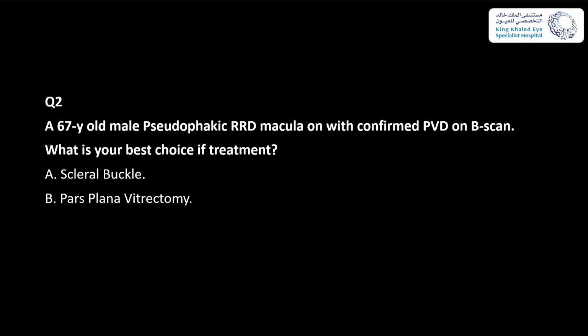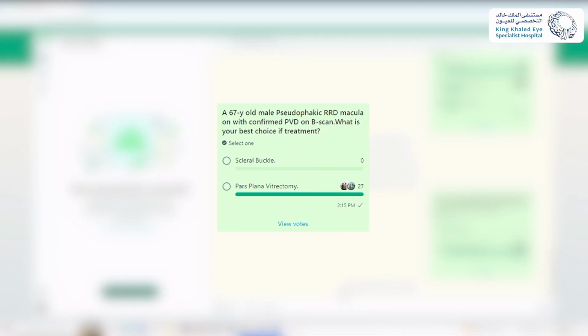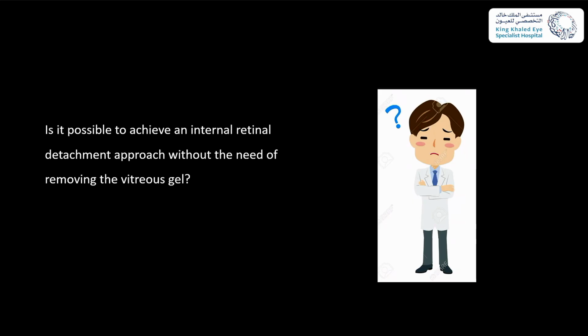So now the picture is totally different. It's very clear that vitrectomy is the better choice for this case. Okay? So this gives us the clue that there is no single best answer always. It depends on the case scenario, so we can customize our management. Okay, back to the presentation.